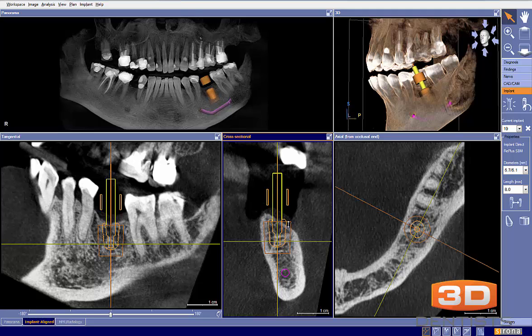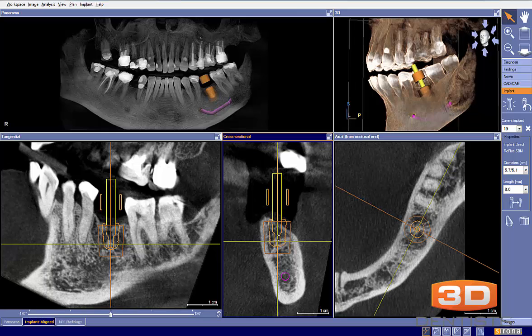I would probably go ahead and graft this area at the time of placement: lay a flap, do some decortication, take some mineralized cortical cancellous bone, mix it with some PRF, place it in this area, then place a membrane and get primary closure. Should be relatively predictable to do. So that's one choice here.